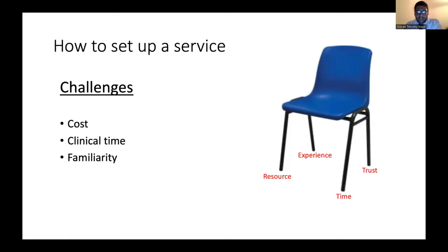So how do you take it from here in terms of setting up a service? Well, for me, the way I think about this is like a chair. You need a certain number of legs to stand on. And if you're missing one of these, you'll struggle. And these translate into particular challenges. You need, at the start, the resource, whether that be the ultrasound equipment or the software, the SonoView. You also need the time, and you need the trust of those around you to do it.